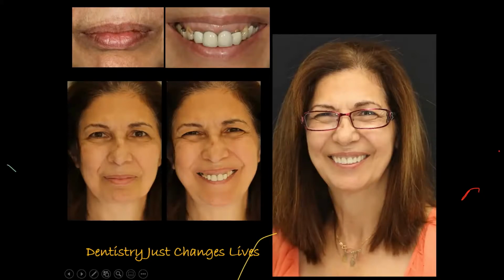And did we really open the occlusal vertical dimension? Perhaps a little bit, maybe 2 millimeters anterior, and that still maintains a good cheek profile. Overall, I think we have improved the patient's confidence in this particular case. And dentistry does really change people's lives.